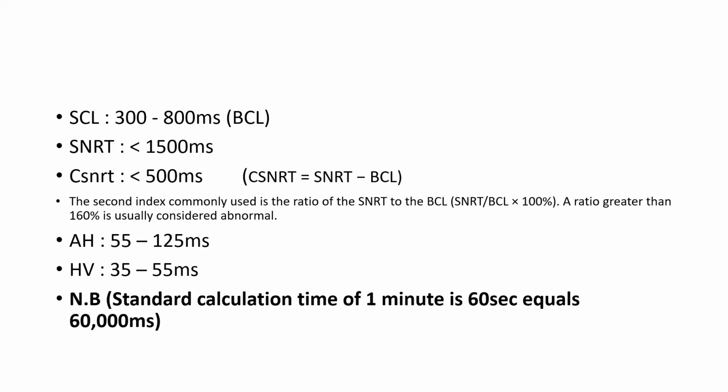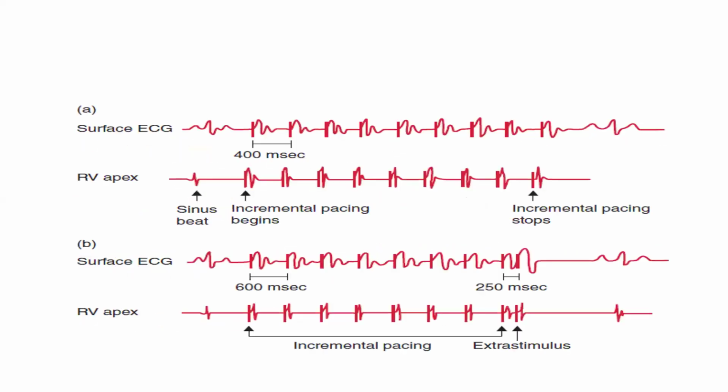So, the time interval between the last time you paced that atrium to the next normal sinus SA node recovery, that time interval is called SA nodal recovery time. So let's show this in this image.